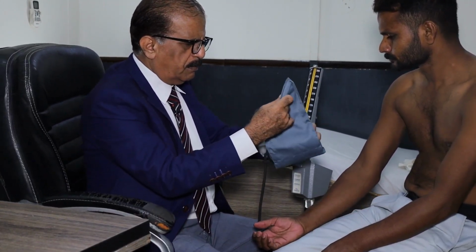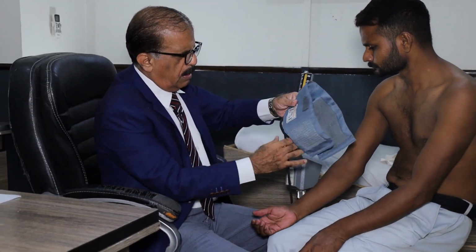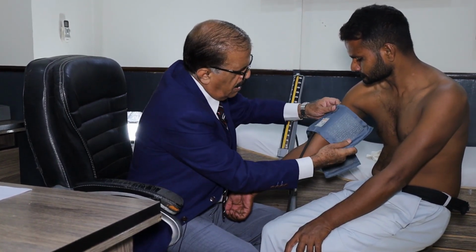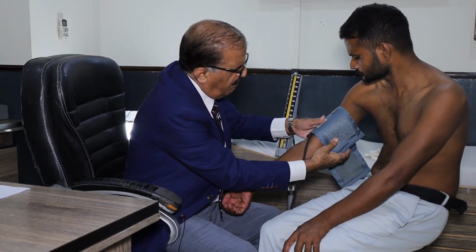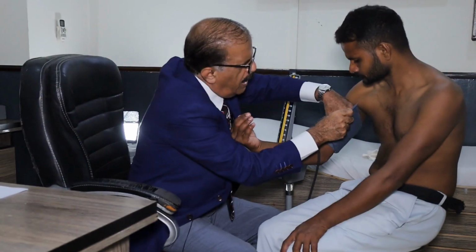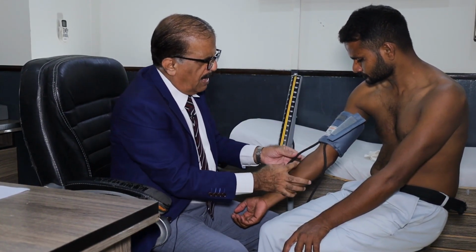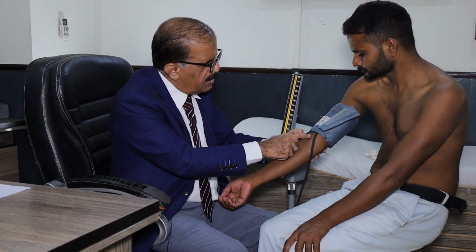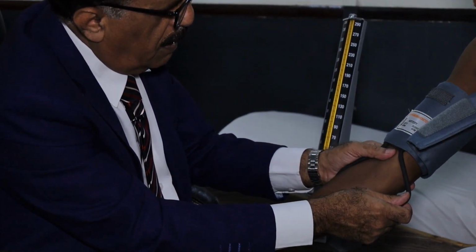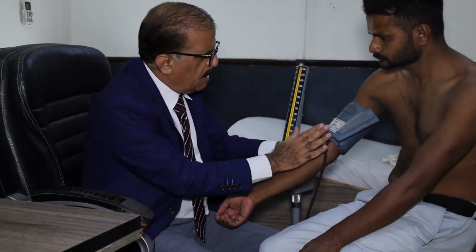So we apply it like this. We actually apply on the brachial artery, approximately 1 inch above this cubital fossa, like this. And it should be applied firmly like this. There should be no air between cuff and the arm. I will put my thumb on the brachial artery, and you know the normal anatomy, the brachial artery is only slightly medial to the midline. So I think it is somewhere here. Yes, my thumb is exactly on the brachial artery. So I can feel the pulse because there is no pressure here.